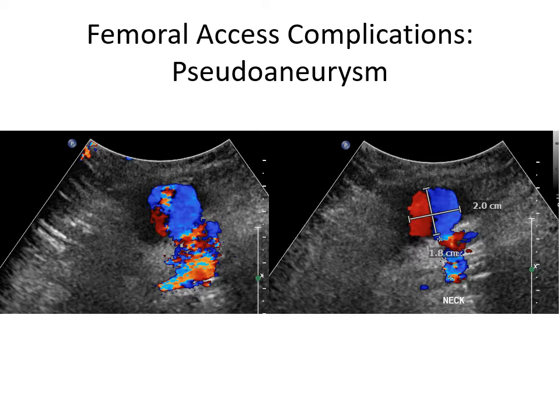Here we show the duplex ultrasound of a groin pseudoaneurysm that developed in an 86-year-old man who presented for coronary angiography. He was found to have left main disease and was given 10,000 units of heparin during the procedure for intravascular ultrasound. Despite a clean front wall femoral artery stick, angiography revealed that the access was low, a closure device was not used, and instead the sheath was sutured in place. It was retrieved around two hours later once the ACT was lower, but a large groin hematoma had developed despite manual pressure followed by a femstop applied.